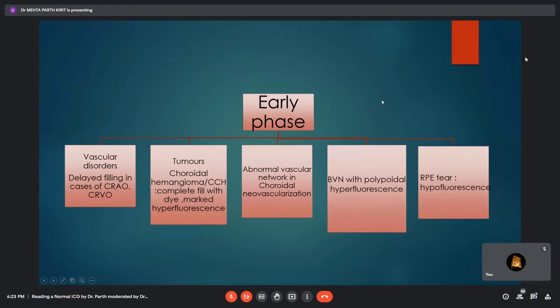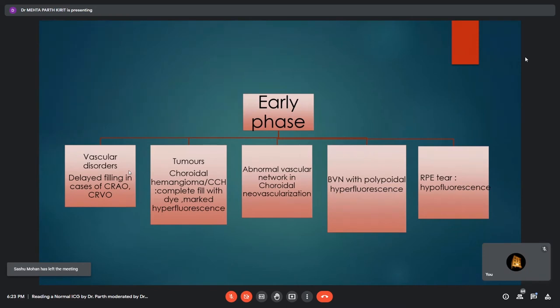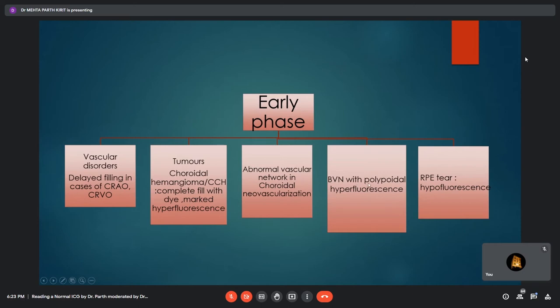In the early phase of ICGA, it is useful for diagnosing vascular disorders like central retinal artery occlusion and venous occlusion, especially in vascular etiologies like giant cell arteritis accompanied by choroidal hypoperfusion. Tumors like choroidal hemangioma show marked hyperfluorescence in the early phase. An abnormal vascular network in cases of CNVM or associated polyps can also be seen. RPE tear shows hypofluorescence in areas with rolled-out RPE.